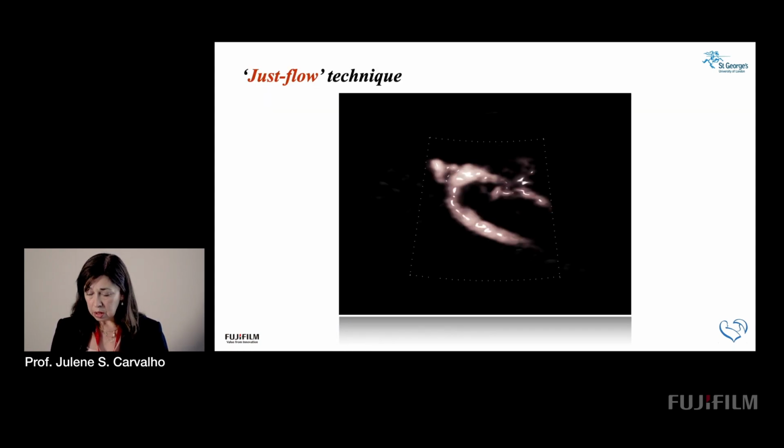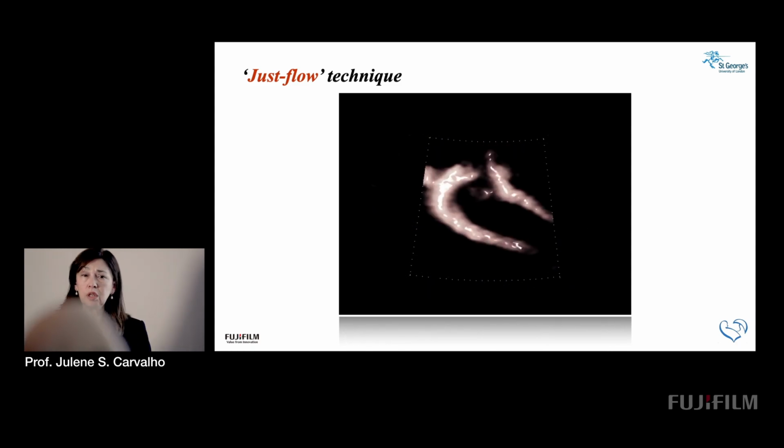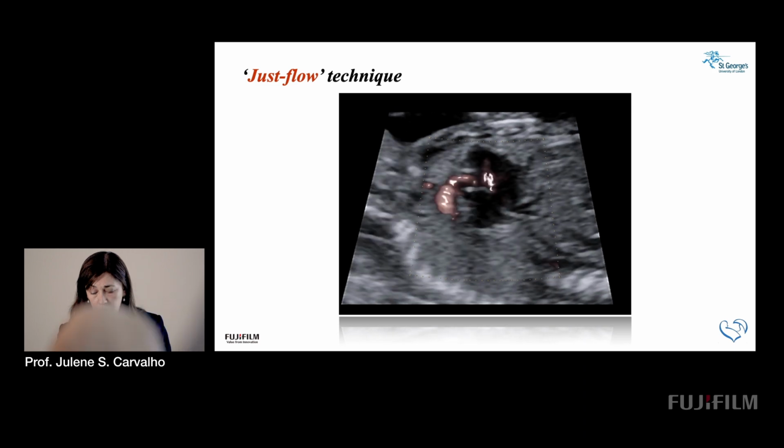And this is something that I introduced some time ago just by chance, trying to optimize the gain between the 2D and the gain that you use for the color. If you start with an image that has the 2D and the color, you can give priority to color or 2D. If you put too much gain on the 2D, you lose the information on the color.